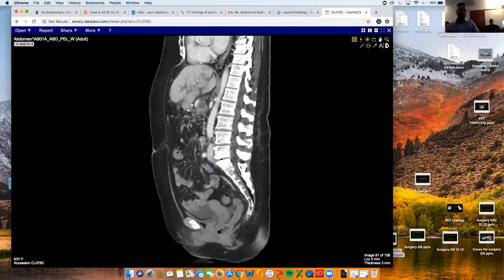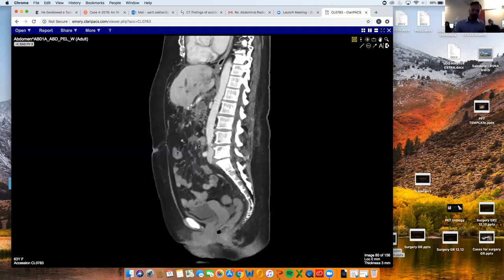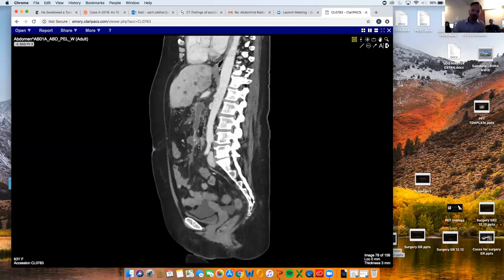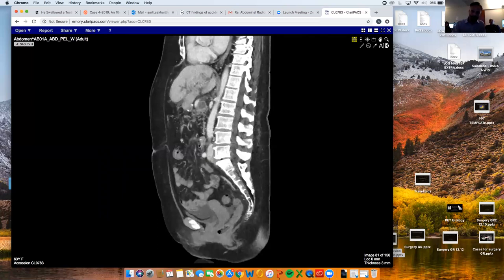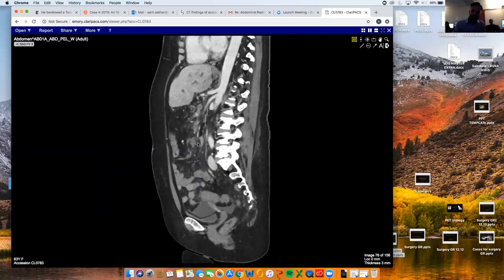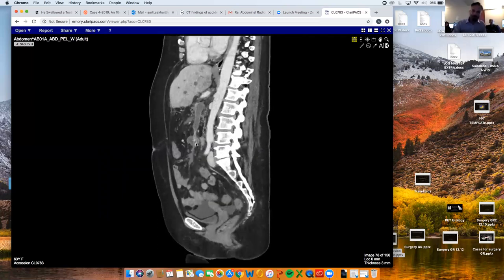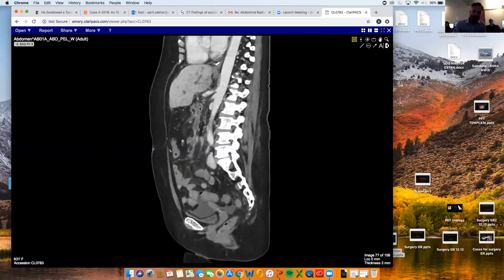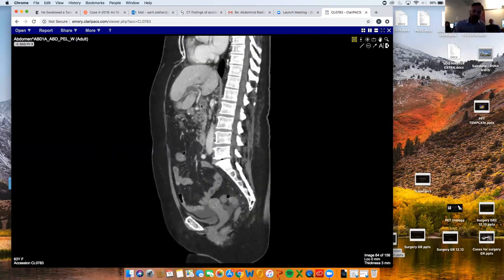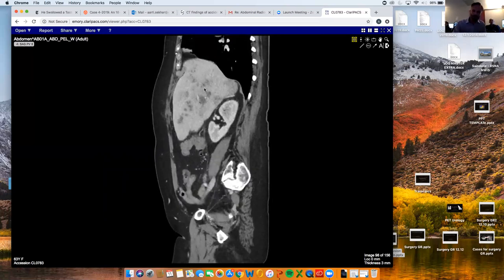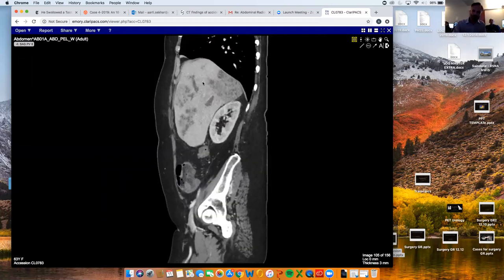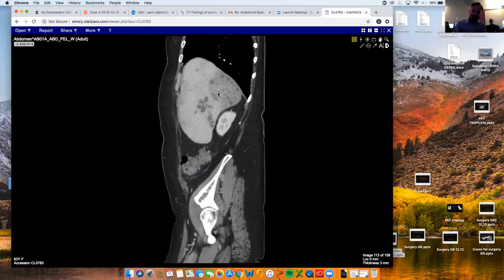So basically putting this all together — oh my gosh — this is what I think is a fish bone that has eroded through her duodenum, penetrated the mesenteric vessels, thrombosed and formed infection. It's traveled out of the superior mesenteric vein into the portal venous system, clotted off her entire portal venous system, and filled the liver with micro abscesses.